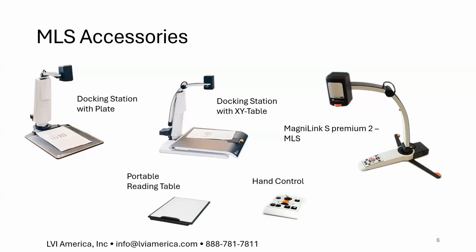So you need to have that hand control in order to be able to utilize it to make it smaller, larger, change colors, etc. if you have it just plugged into a monitor. All of those features, when you're using our PC viewer, Mac viewer, Chrome viewer, or a MagniLink viewer software, are built into the software. But if you're just using it with a monitor, you would need to use the actual controls on the unit.